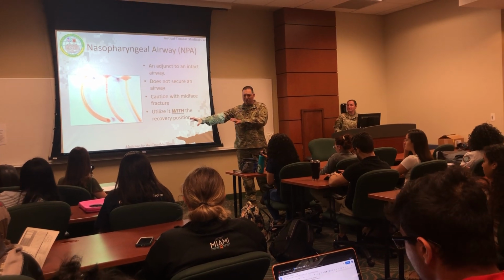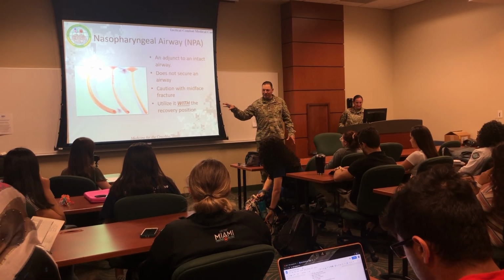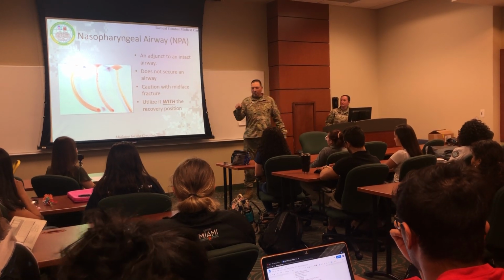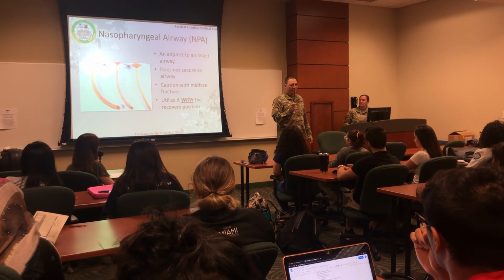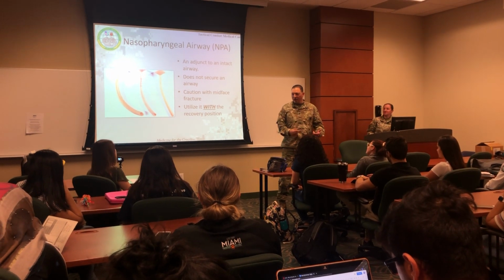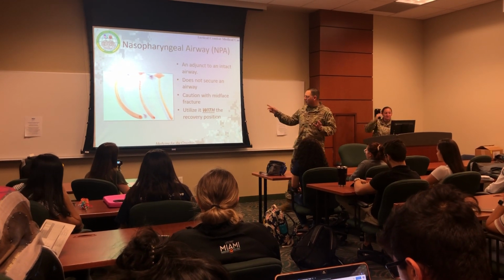One thing that you should always try to do, and we're going to get into it when we do the airway management, is as you're administering that airway adjunct or whatever you're going to use to establish the airway, hold your breath while you're doing it, and you'll see that that's how long that person is also without oxygen. It'll give you a sense of urgency. If you don't have a sense of urgency already, and they're hurting for oxygen, and you're holding your breath, you know just how bad you need to establish that airway for them so you can breathe for them with that bag valve mask if you need to, right? So next slide.